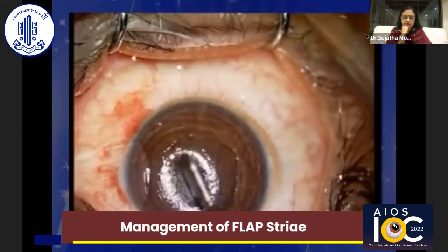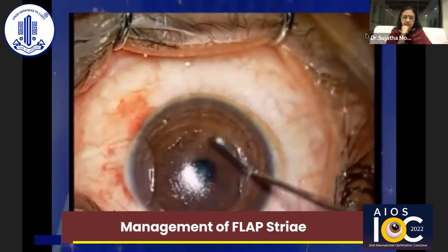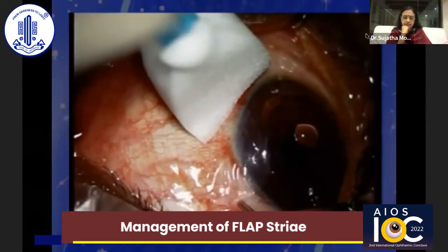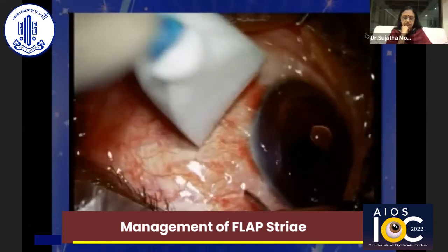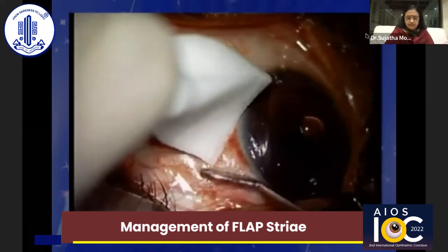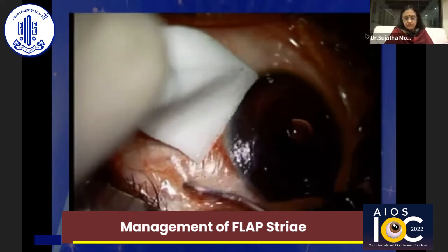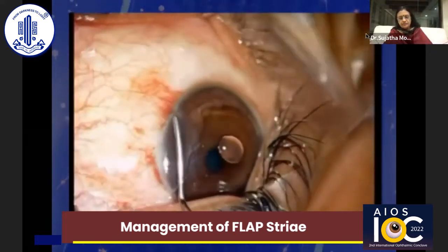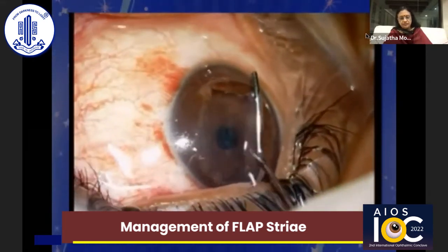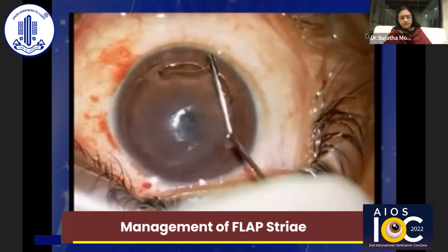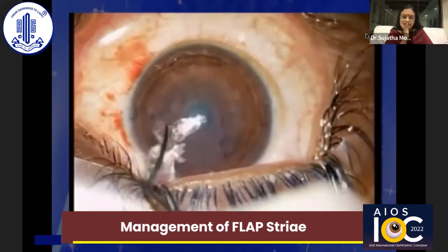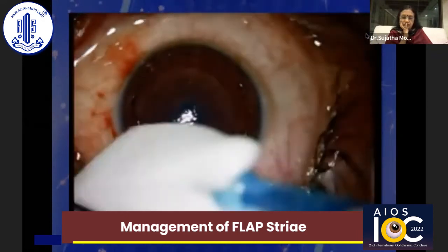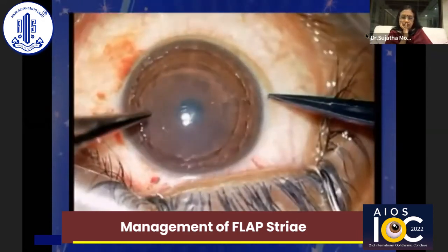The fourth case shows a completely displaced flap with rolled edges. This video highlights the importance of removing epithelium under the surface of the flap in addition to the stromal bed. The rolled-up flap edges are gently scraped of the epithelial ingrowth and replaced. Suturing the flap is mandatory in this situation to prevent repeat flap slippage and epithelial ingrowth.